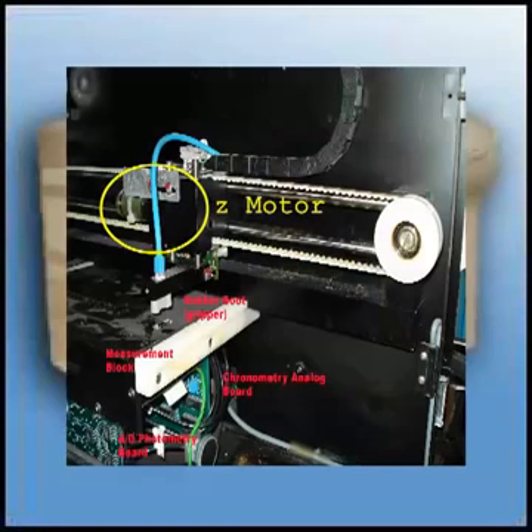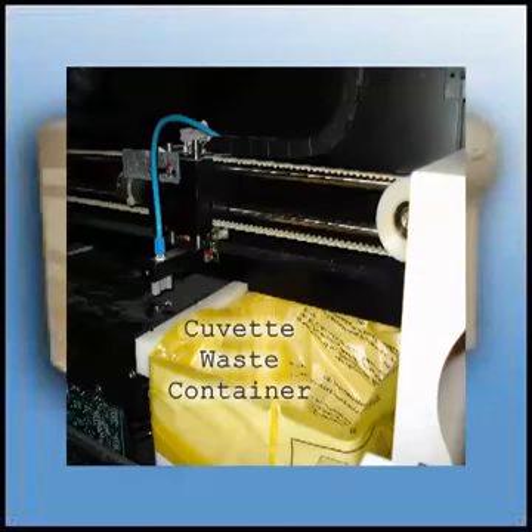This is also a good picture of the chronometric analog board for clotting tests and the A-to-D photometric measurement board for optical measurements. In front of the measurement block sits the waste container for the cuvettes. The cuvettes are disposed of here after the measurement cycle. The cuvette waste drawer rides in and out on a steel guide rail.